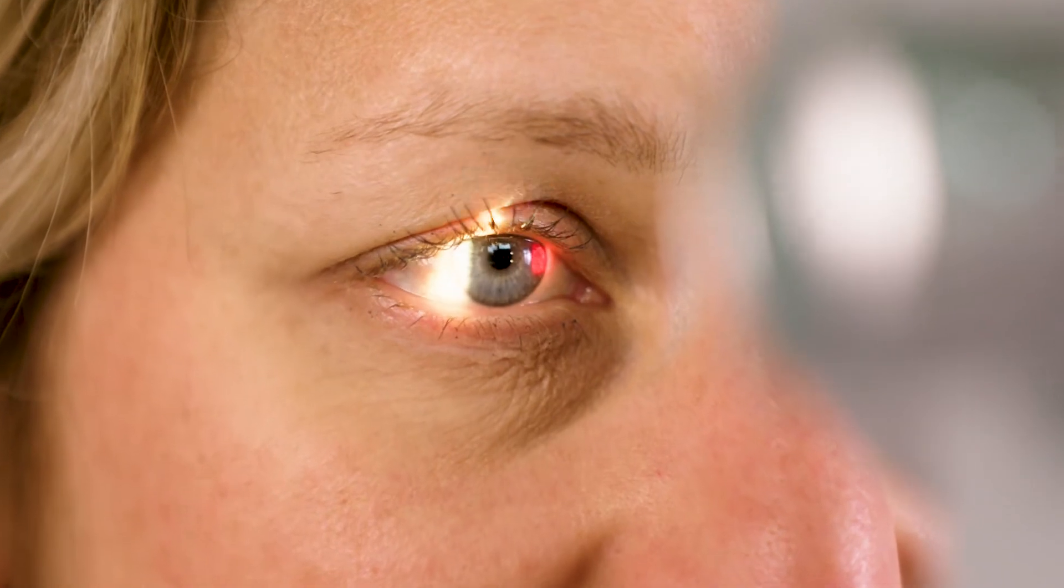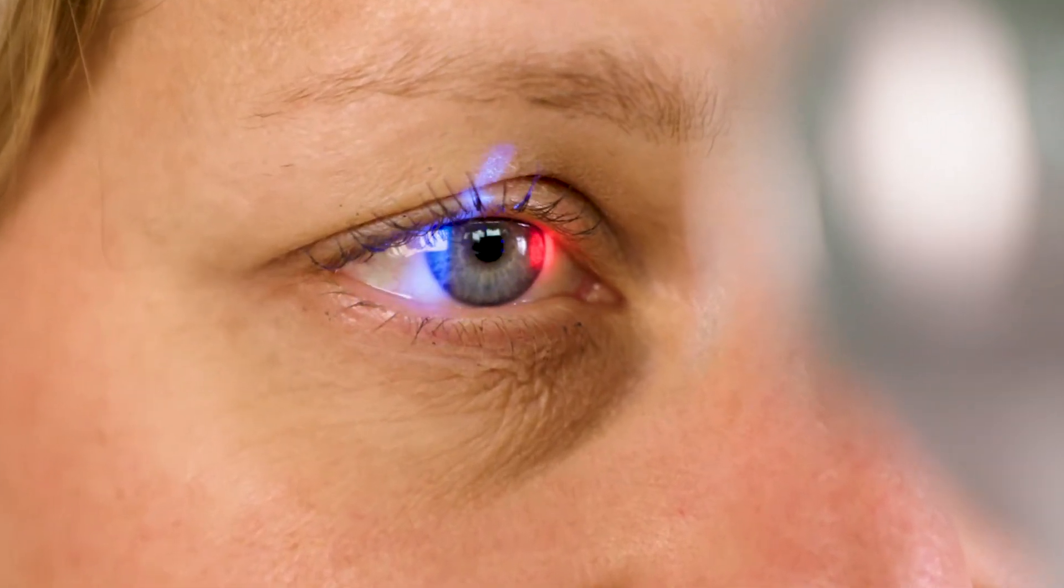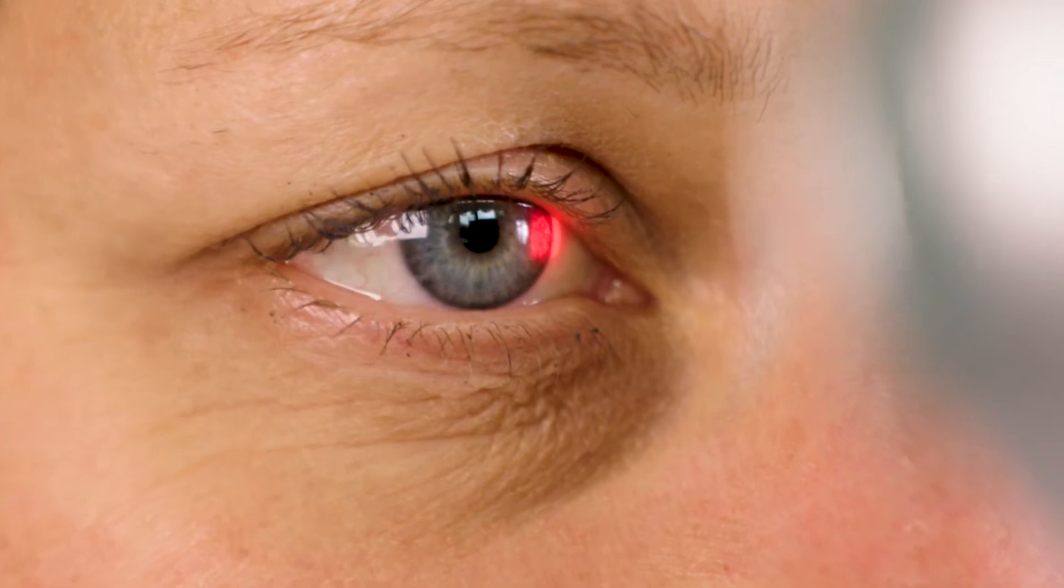and this is unique for the 2RT treatment, we can't see the laser spots. We only see the target beam and can thus place the laser spots at the upper and lower vascular arcade.